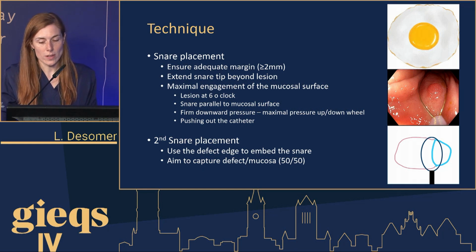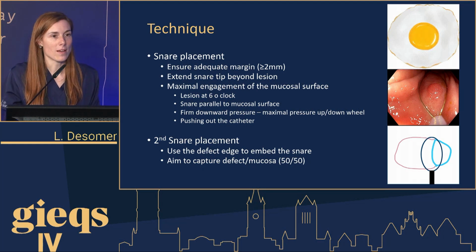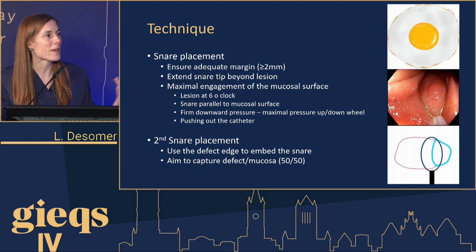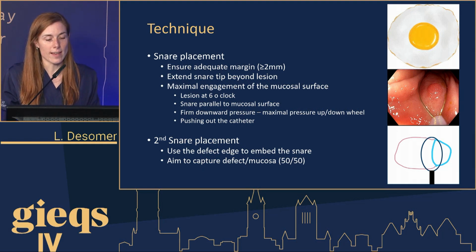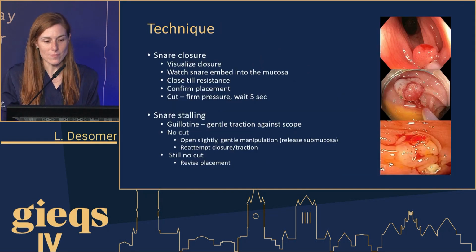If you're not sure, just get a second bite. Better that than having to come back 5 years later, which is your normal surveillance maybe that you would have done, and find a recurrence and all the problems that come with that. So aim for the fried egg.